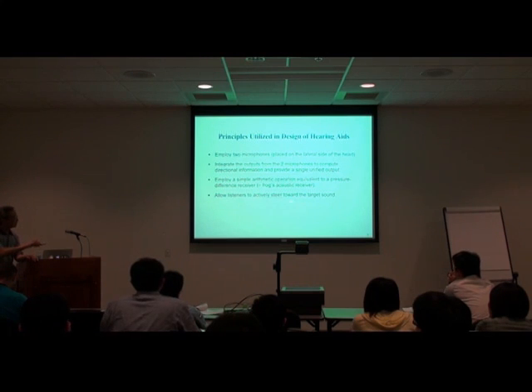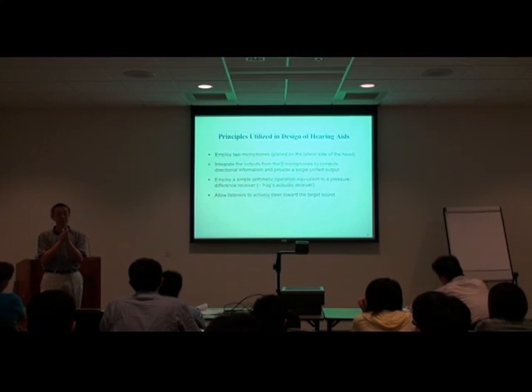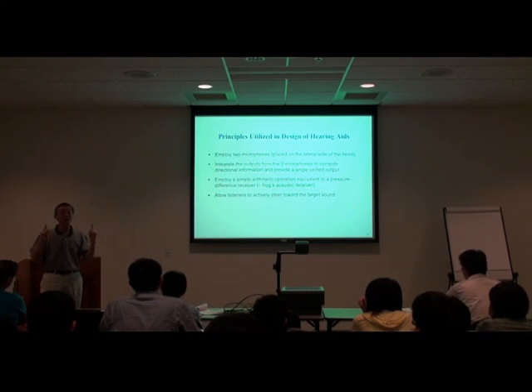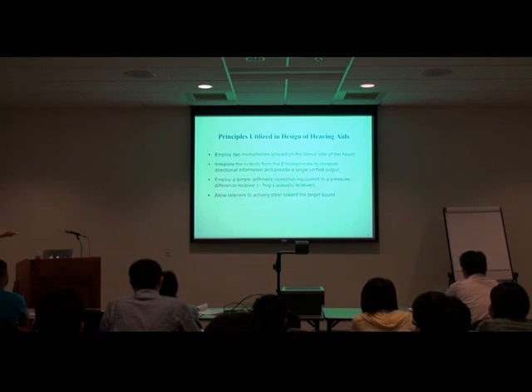And then we want to allow the listener to determine which target is the target of interest and let the individual regain control as an active listener. Remember, when you wear hearing aids, you're strictly at the mercy of the device performance. And devices, as I said, remove your ability to actively listen. We want that to be returned to the owner of the device. We want the listener to be able to actively steer the target signal.